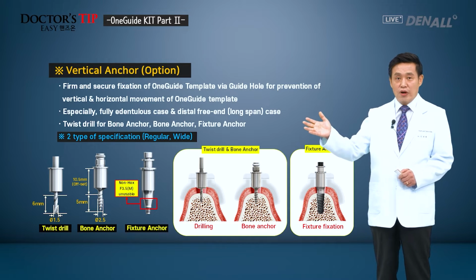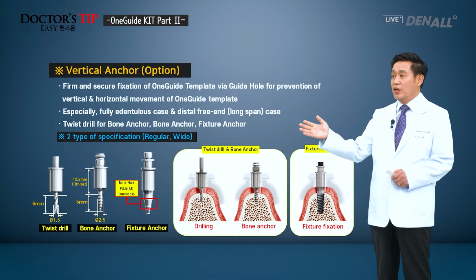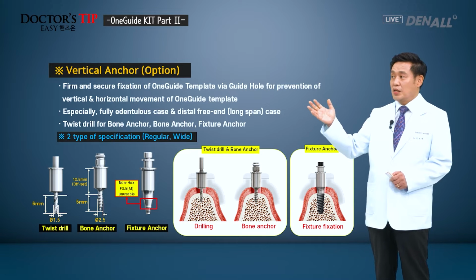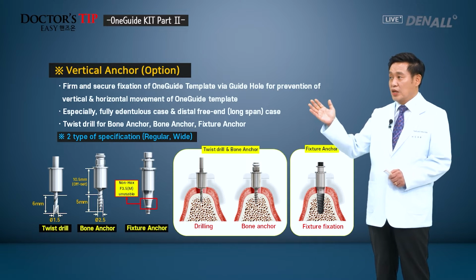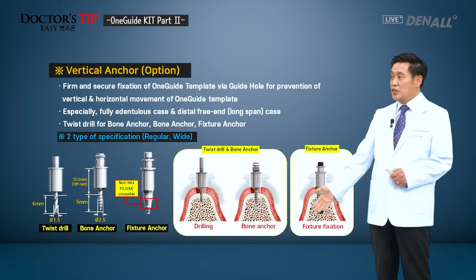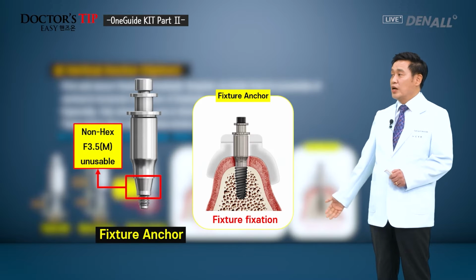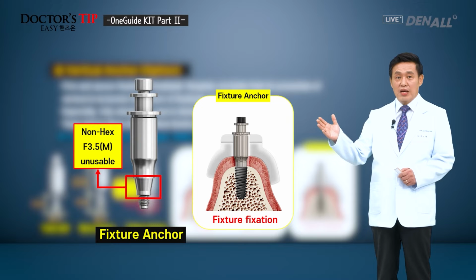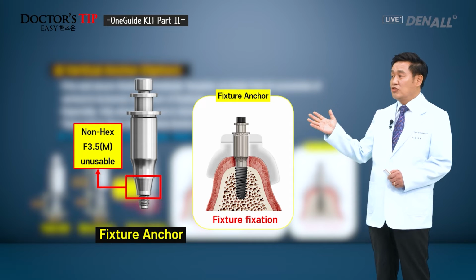Use vertical anchor, and if you use lateral anchor system, you'll be able to accurately position the surgical template. After removing the bone anchor system, place the fixture and connect the anchor. Using fixture, you can get vertical anchorage as well.